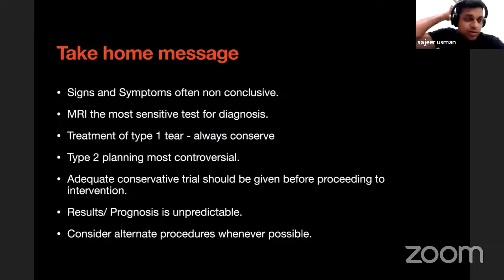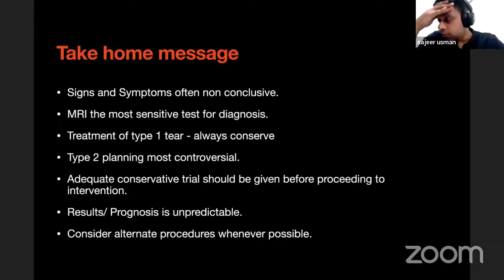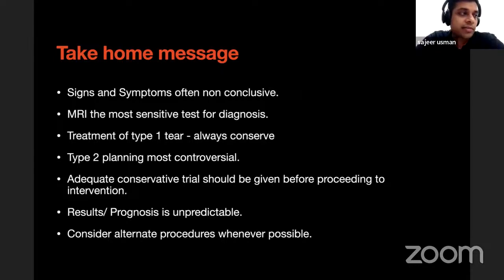No, personally, I don't do a lot of SLAP repairs. Only if it's a part of a global labral repair, the SLAP is addressed. But I would like to really carefully look at MRIs to find those bucket handle type of SLAP tears. Because I feel those are really symptomatic, and just excising them itself also sometimes works.